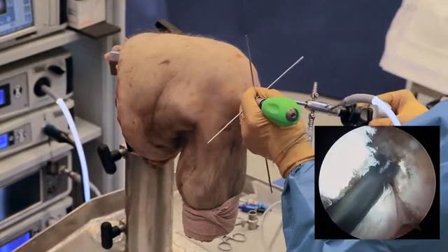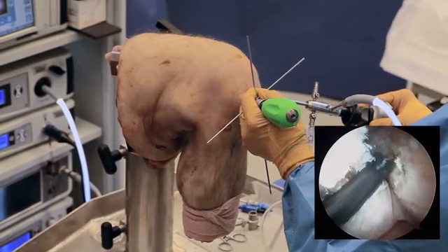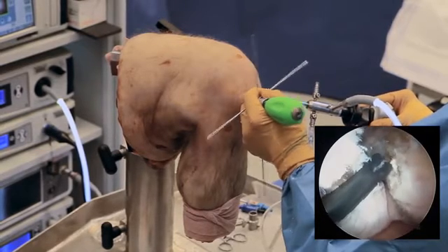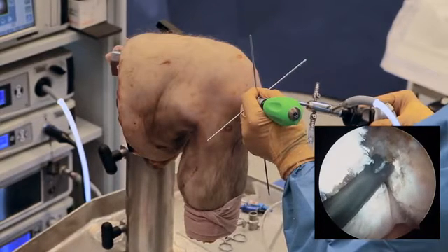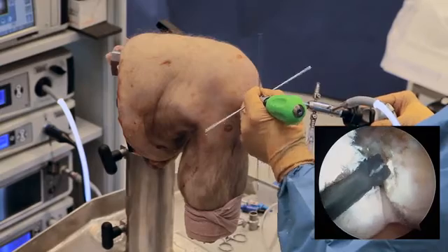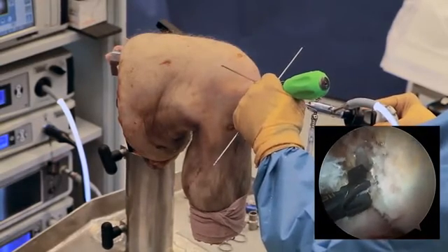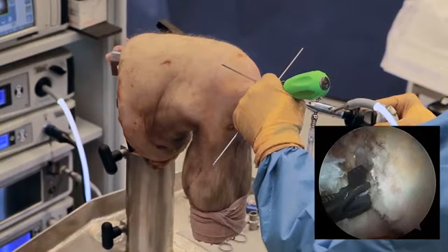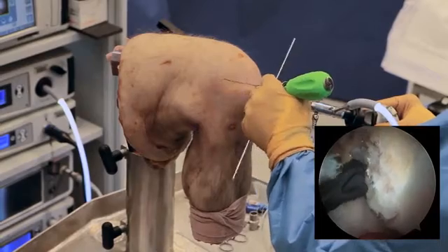Again, it's not too vertical like this, so it's not exiting straight through the anterior cortex, which would suggest that I'm going to be too vertical with my graft. And the trajectory guide is not going too low and exiting very far posteriorly on the lateral cortex, which would suggest that I would have a short tunnel.